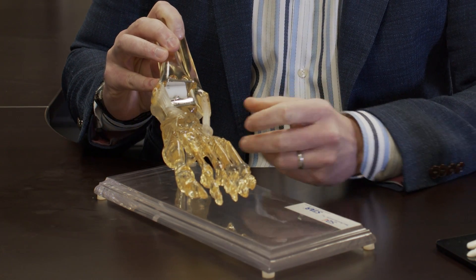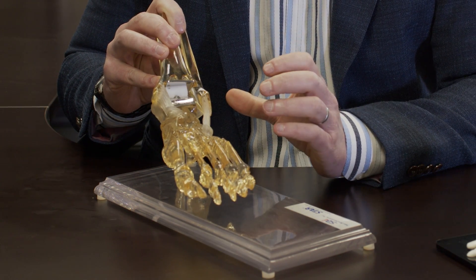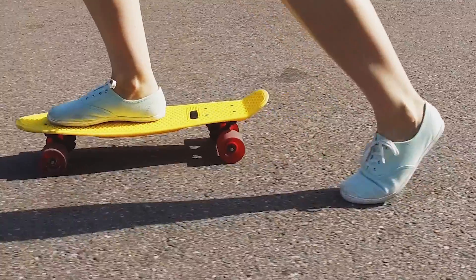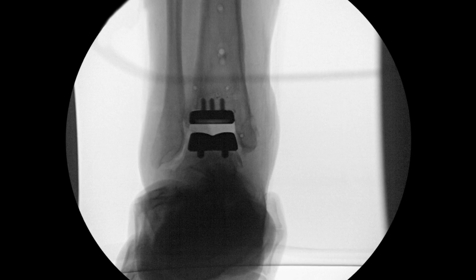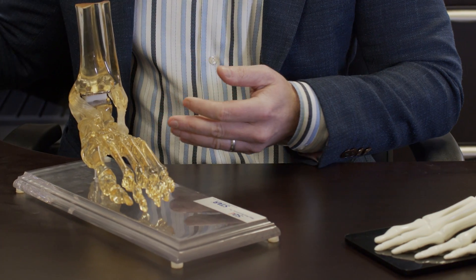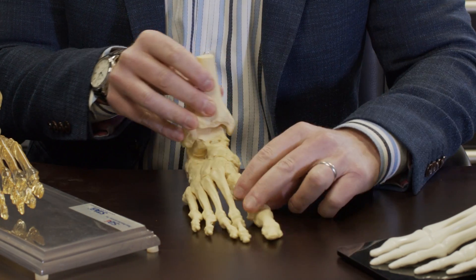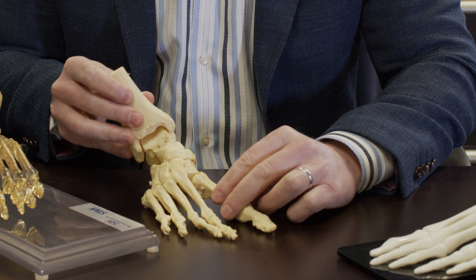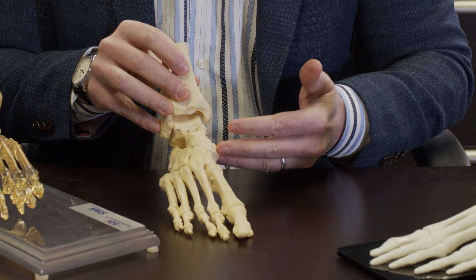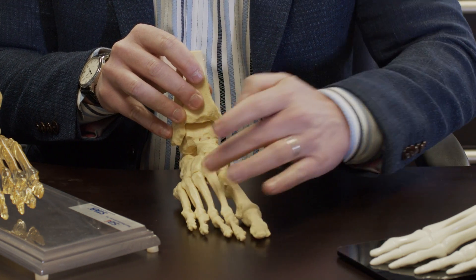Once we've done that, we check the balance of the ligaments to make sure everything is appropriate. We many times have to rebalance the foot or the ligaments. There are multiple bones, joints, and ligaments, making a very dynamic structure. The foot can flatten or have too high of an arch, so we use different ligament reconstructions to balance the foot so we have a normal tripod — three points of fixation when you stand.